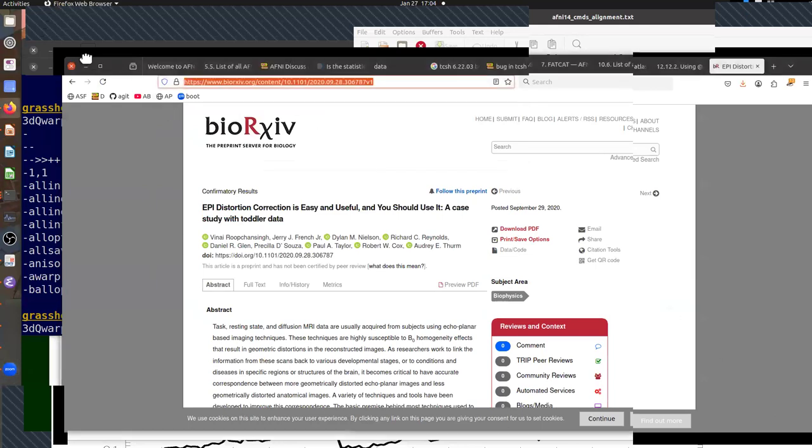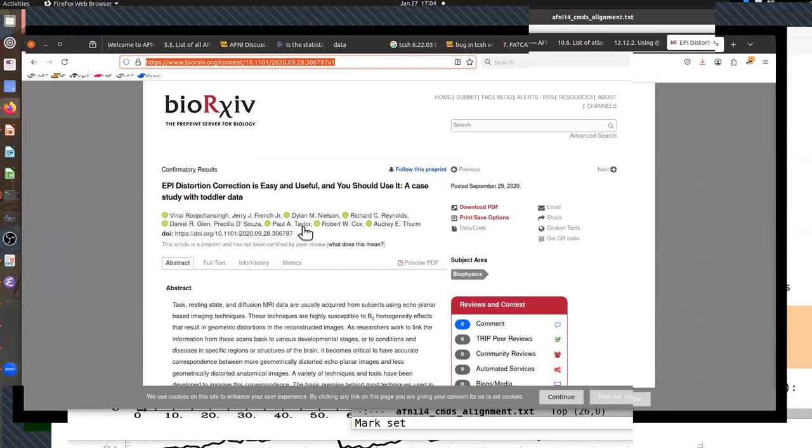That's using both AFNI and FSL and looking at both phase distortion, like the phase map, and the reverse phase encode. Both of them help you. Whatever software you're doing, do one of them. In practice, it just seemed to be that the reverse phase encode did a little bit better. But yeah, it's definitely worth doing one of them. Excellent questions.